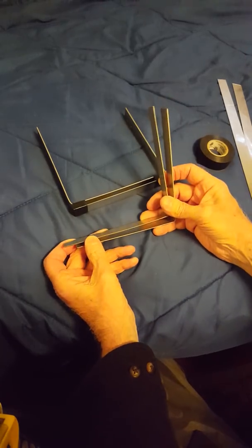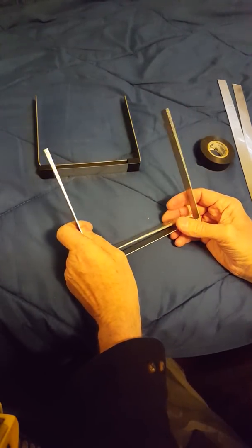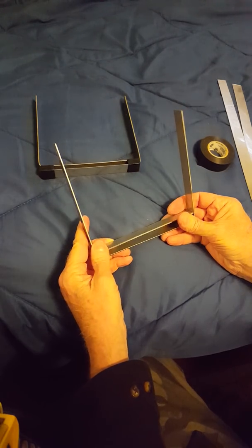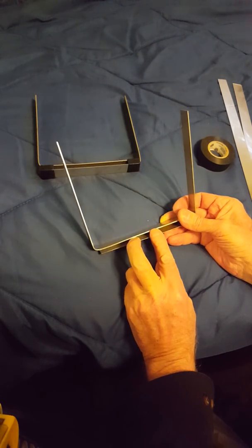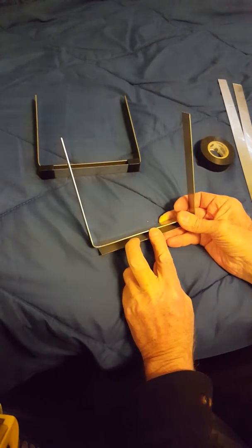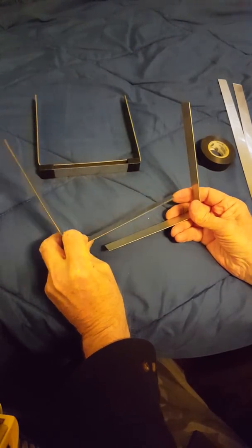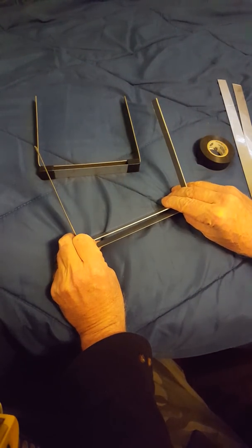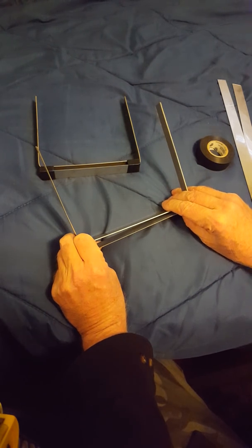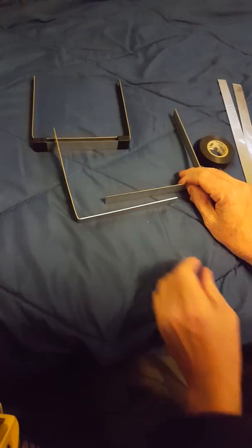Once you have these in an L, there's something unique about this particular design, in the fact that you hook these together and the corrosion will occur at the base along these plates here. But you don't let them corrode all the way through. When they look like they're getting pretty questionable, you cut the entire thing apart and you invert like this so that you have new material on the bottom, and invert this also. So that way it lasts twice as long as a normal electrode, which saves you a lot of money. But let me put this together and show you how this is done.